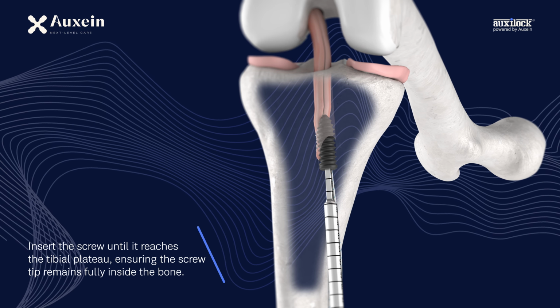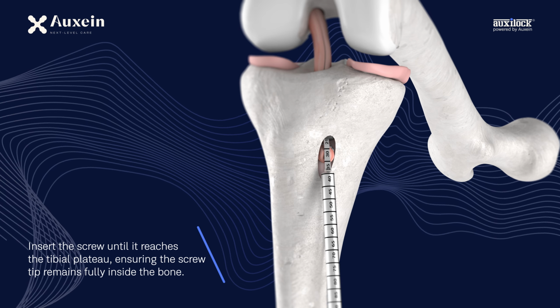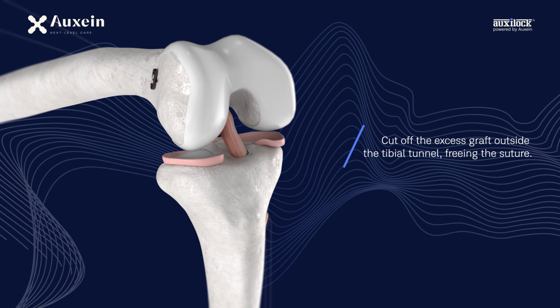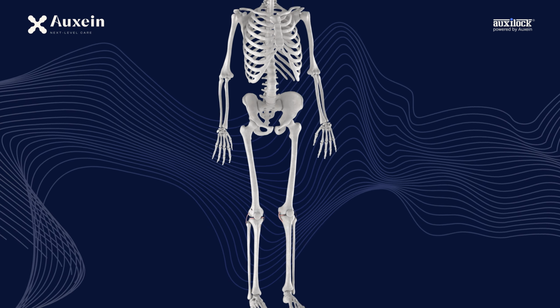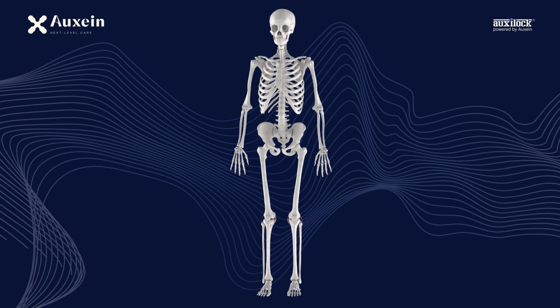Insert the screw until it reaches the tibial plateau, ensuring the screw tip remains fully inside the bone. Cut off the excess graft outside the tibial tunnel, freeing the suture. This completes the ACL reconstruction using the GFS Ultimate Mini and Bio screw.